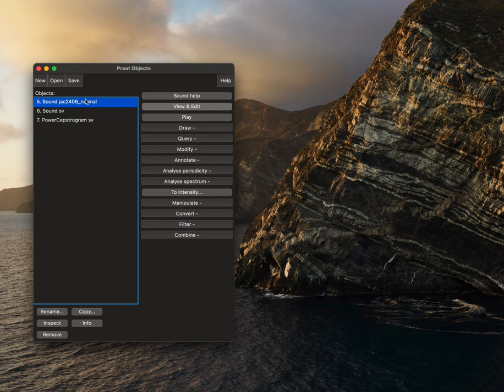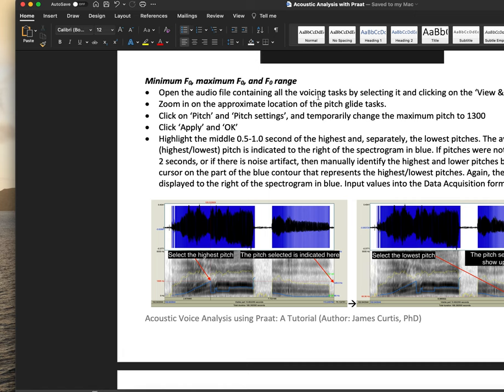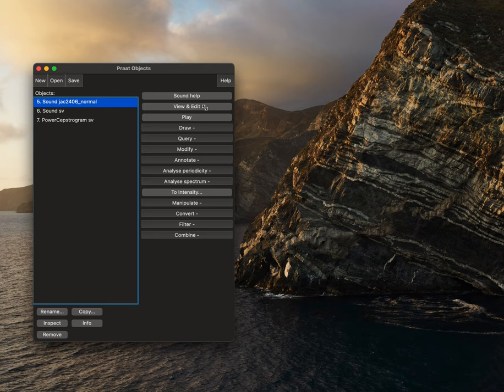A couple more of our non-speech measures will be going back to our main audio file. We'll select view and edit.